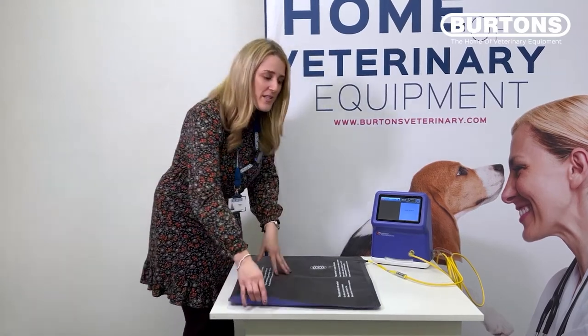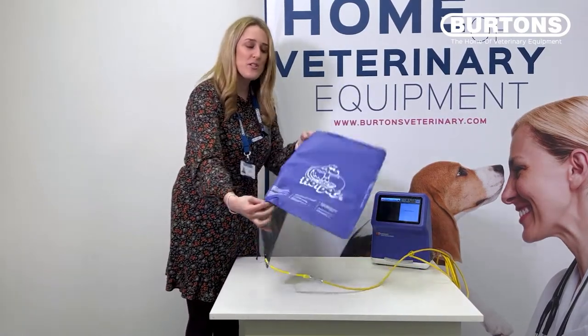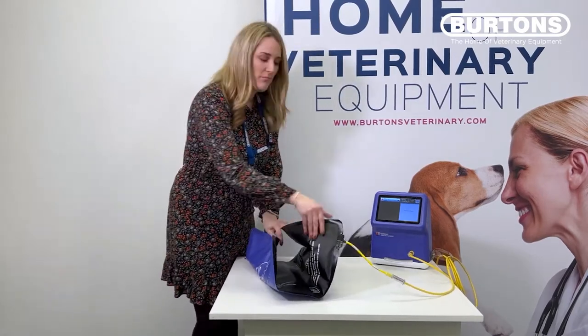When you use these mats, you'll see how flexible they are. They can go under the patient, they can go over the patient, and if you have a patient small enough, you can actually fold them up and use a clip to keep them nice and warm — like a literal hot dog.